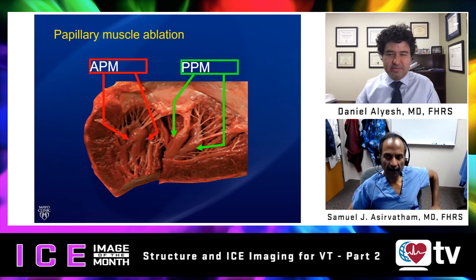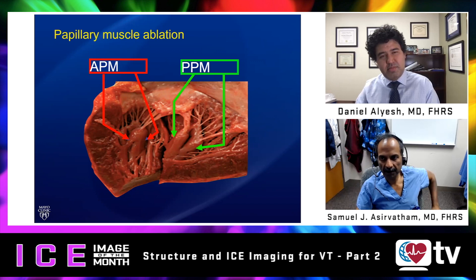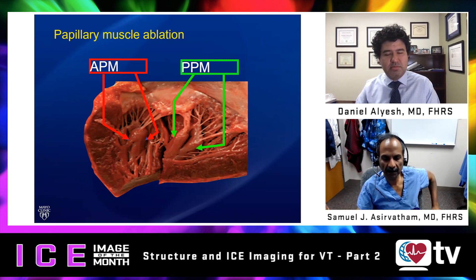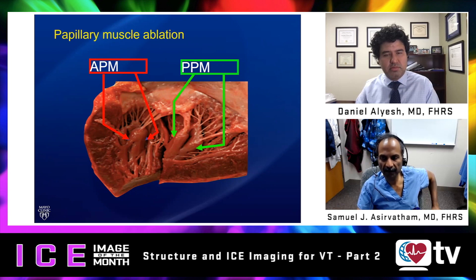In our part one, we looked at some critical structures in the outflow tract — the anteroposterior relationships, the coronary vessels, the appendage, and the pulmonary trunk. Now focusing on some other key areas where VT ablation is not only facilitated, but sometimes really only possible when we have real-time visualization of our catheter and the critical structures.